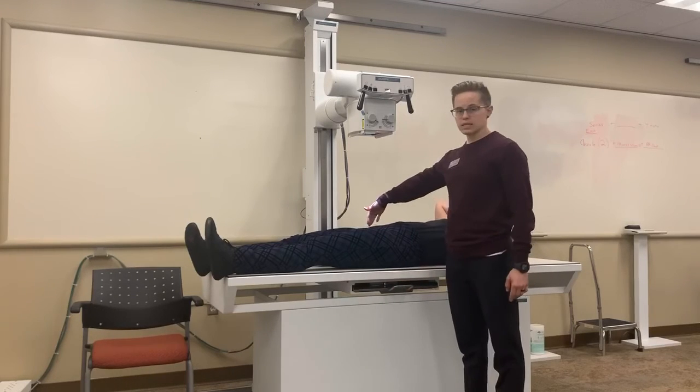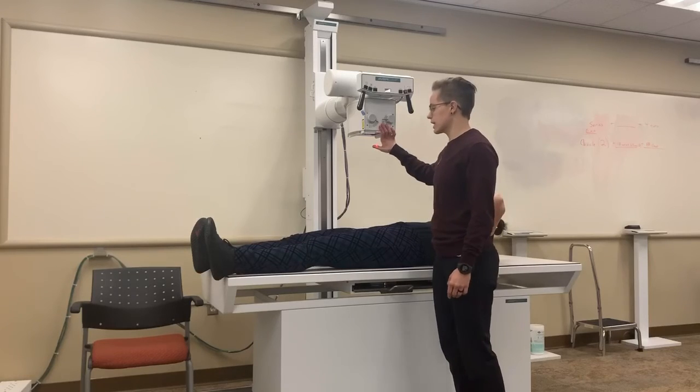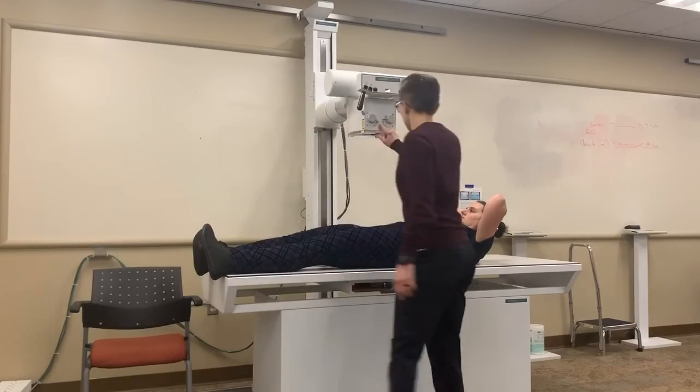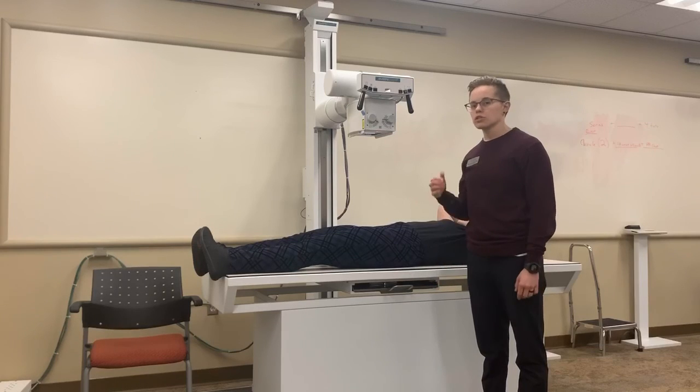My central ray stays the same, so we're still at the hip joint, 1 inch medial, 3 inches inferior to the ASIS. However, I still need to internally rotate that foot approximately 15 degrees. My collimation would stay the same as the frog leg because I collimated just under film size. Don't breathe, don't move.